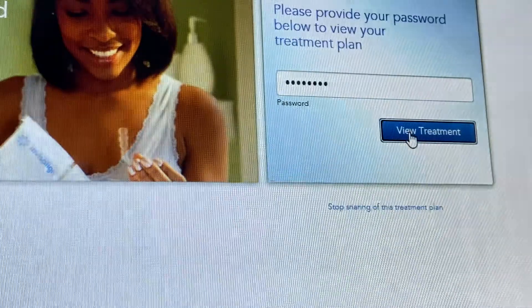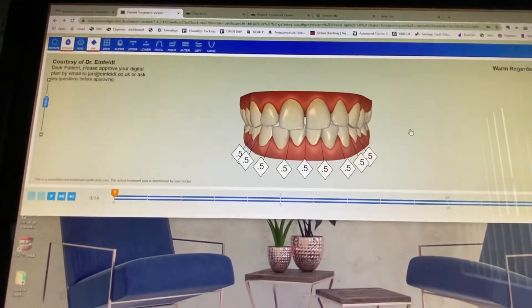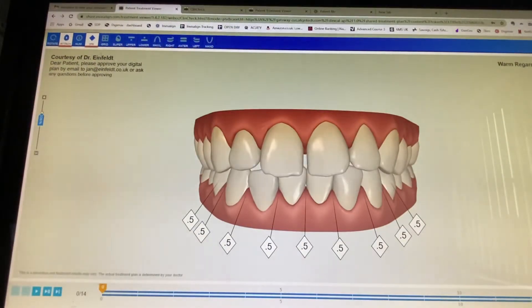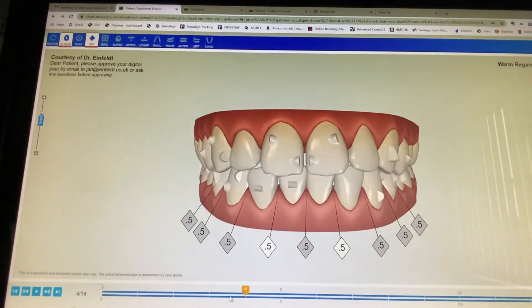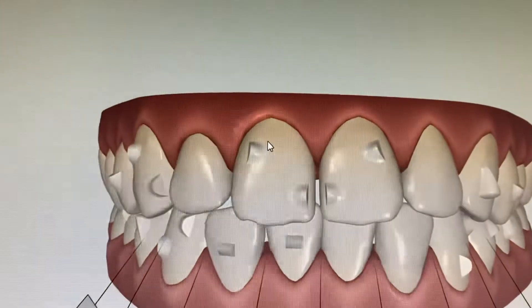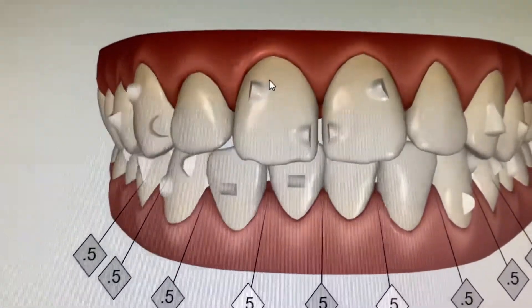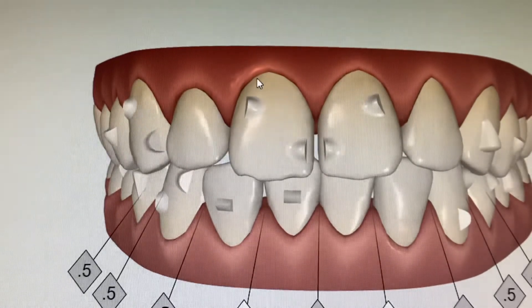Click 'View Treatment' and you will see something that looks like this. Here you've got your plan. You can use the slider on the bottom. This is something you didn't see on the simulation, but this is the real digital plan. You now see these white bits sticking out — those are the attachments, and that is where you are going to have your attachments placed.